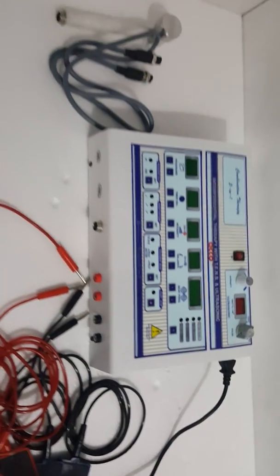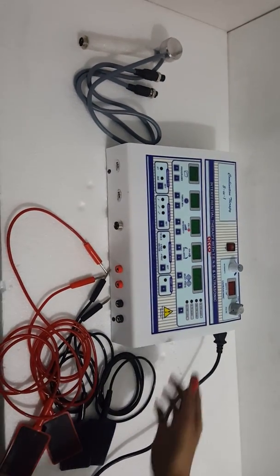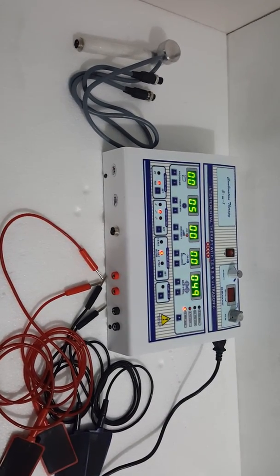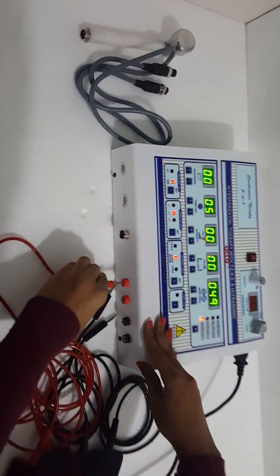Now I will show you the demo of echo combo ultrasound and IFT unit. Switch on the machine. Firstly, we will start with IFT — attach a wire and pass.